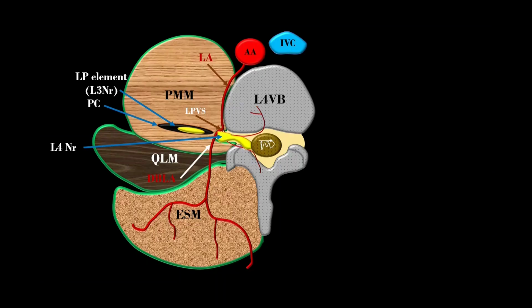Next, the catheter migration is also a major drawback. It can migrate into the blood vessels or towards the intervertebral foramina, resulting in various complications. I will come to that later.